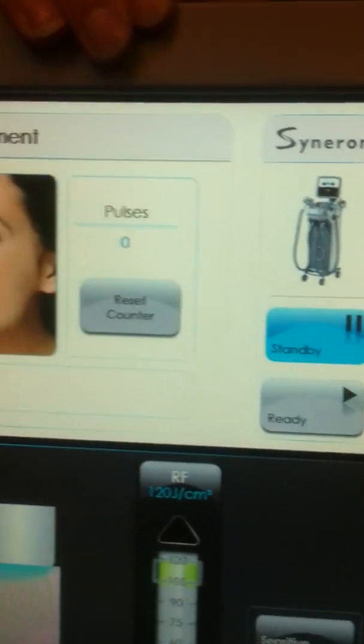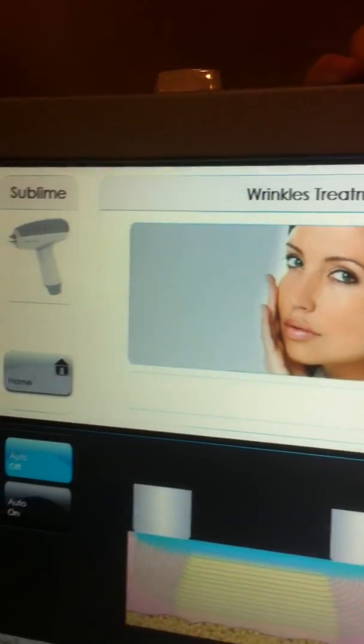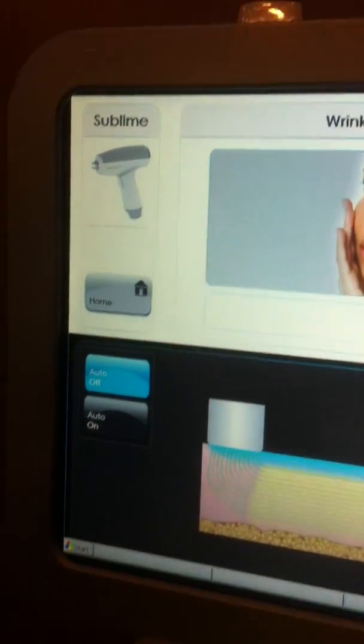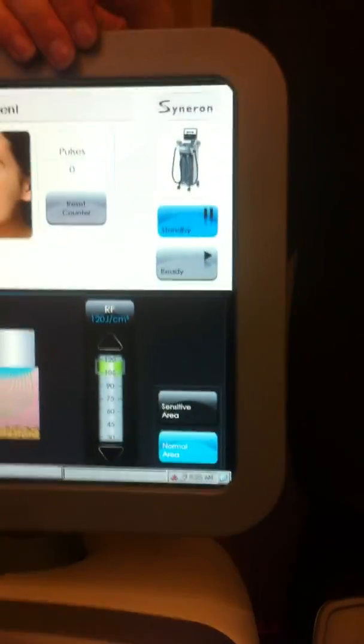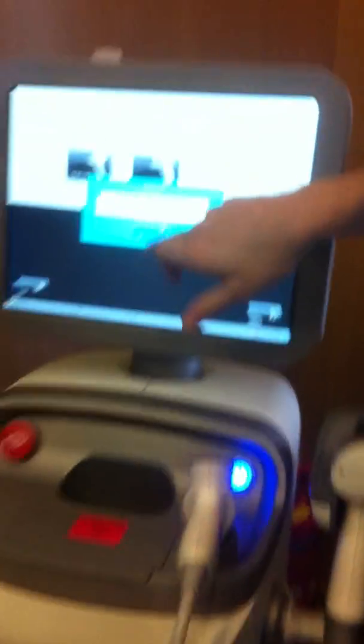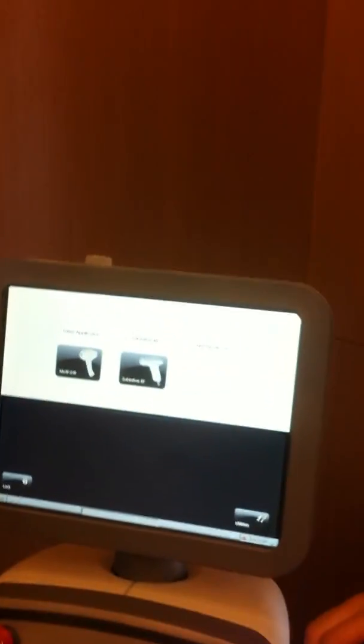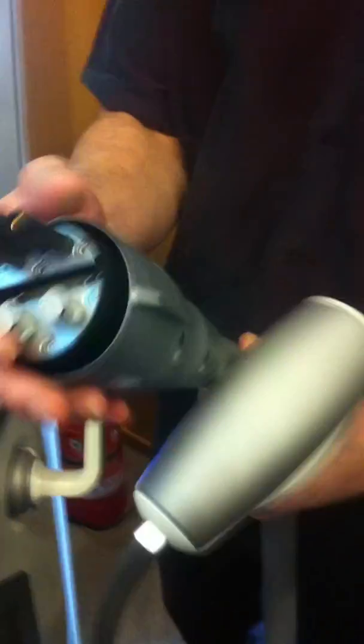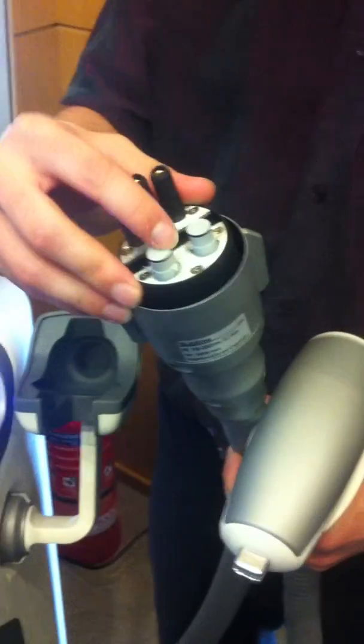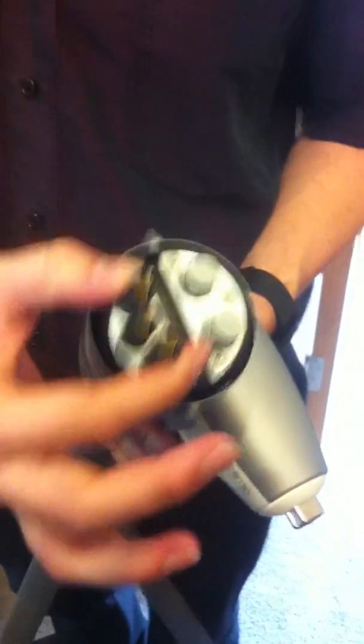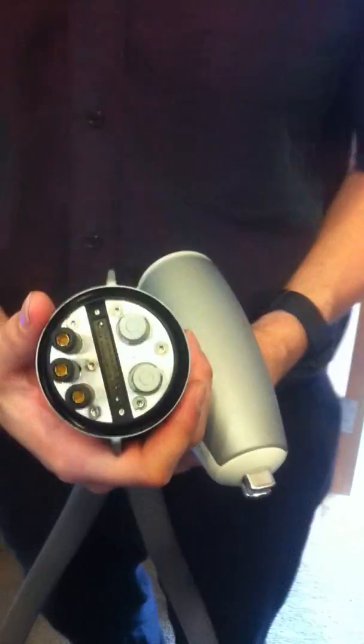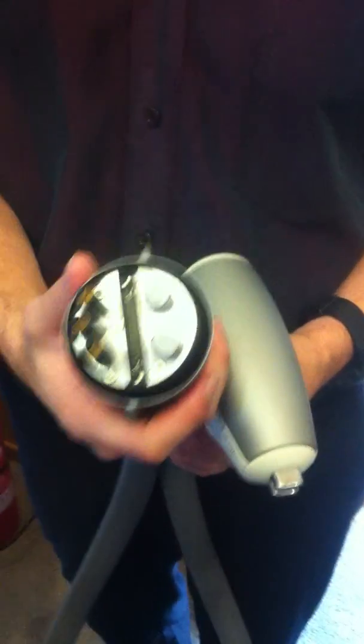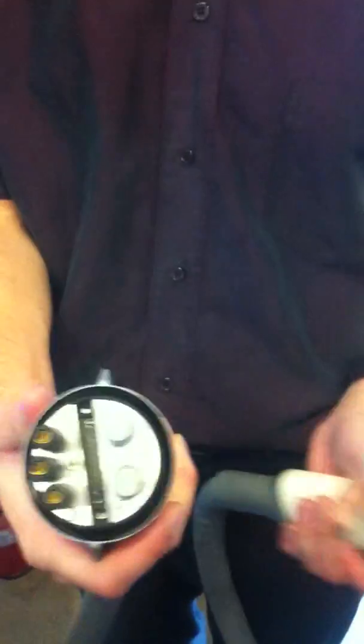Let's see if I've got a tip here. Have you put the IPL on here? Because it takes SRA, doesn't it? Yeah, I'll get an SRA applicator. No, they're different connections. They've changed. They're a hot swap. So you can see as soon as I pull it out. So yeah, we've changed the connectors. The reason is that, first of all, these are metal connectors. And they're smaller and significantly better as far as their lock-in mechanism.